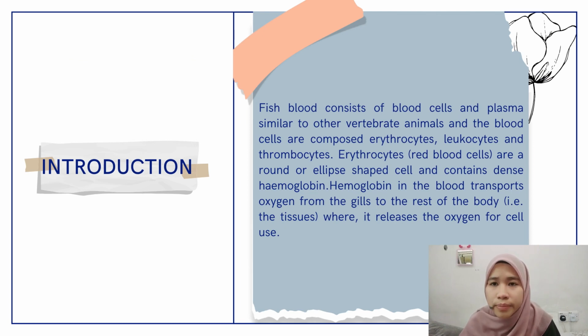For this lab is about fish hematology. So the title for this lab is the characteristic of fish blood, red blood cell in fish hematology.